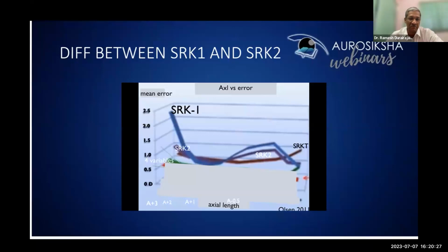These are optimized based on data from white eyes, and their ratio between the posterior segment and anterior segment is different from the ratio in eyes that we find in the Chinese, South Asian, Indian, and black races. So all of us have different ratios, and most of these advanced formulas are optimized to Caucasian eyes. So we all should use a formula which works for us.